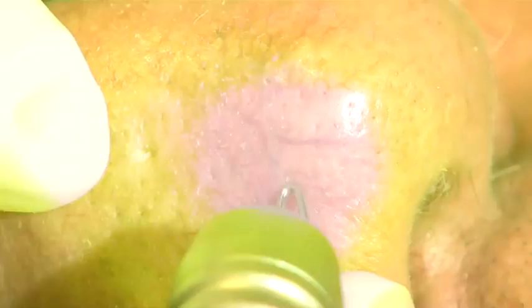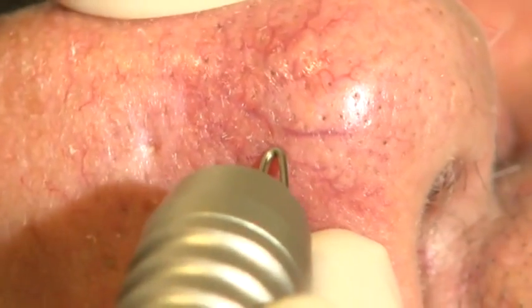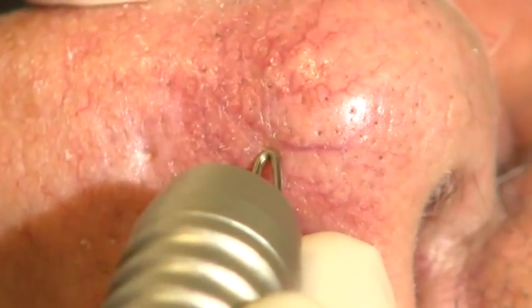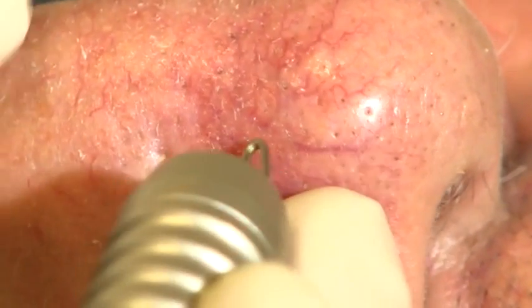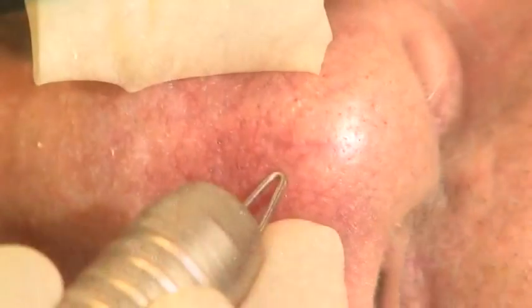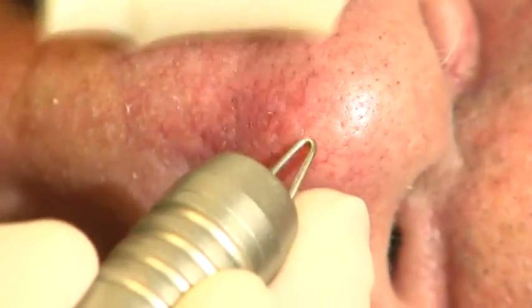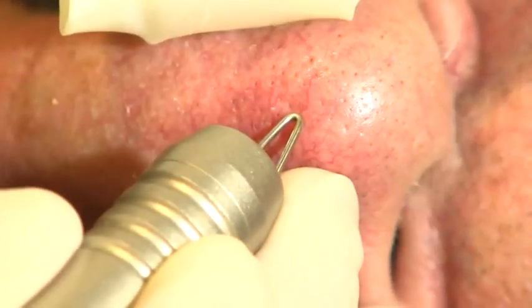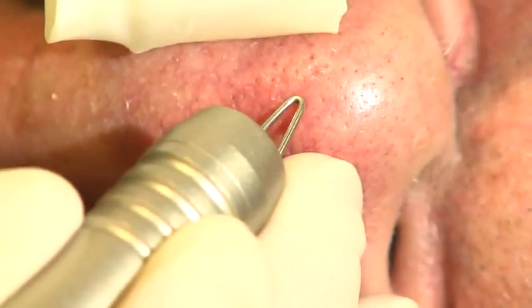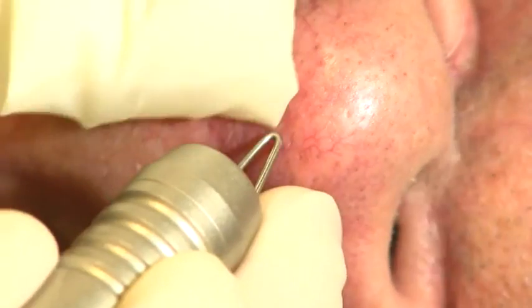Treatment should continue until all vessels have been obliterated. There is no harm immediately retreating a vessel which is not blanched, although care should be taken not to pulse stack. A useful hint when treating sensitive areas like the nose is to rub the skin between pulses or to use an ice pack. This reduces the typical hot pinprick sensation. Most laser treatment of telangiectasia is tolerated easily without any form of anesthesia.